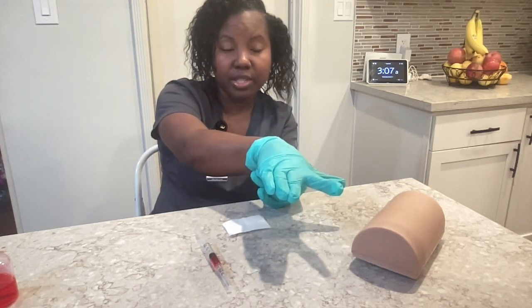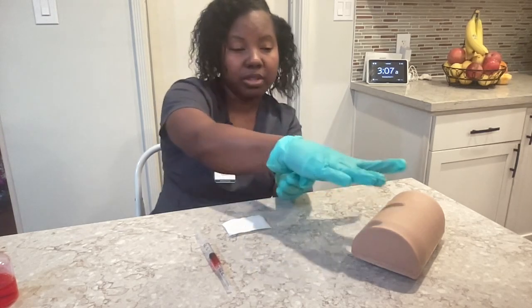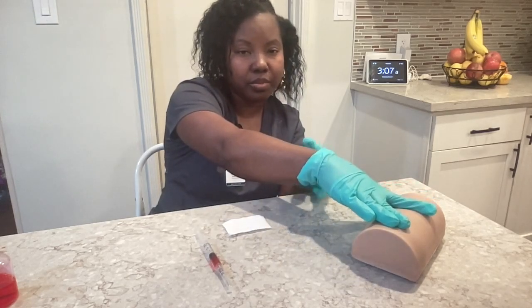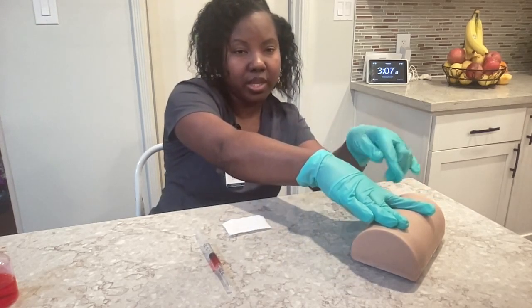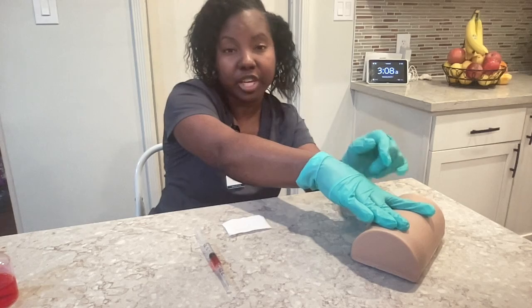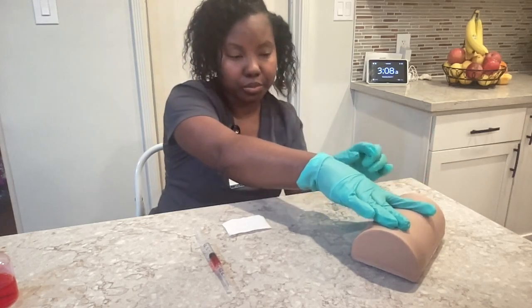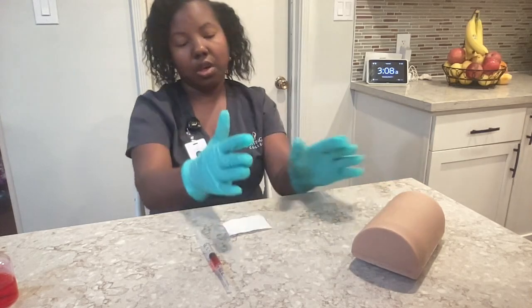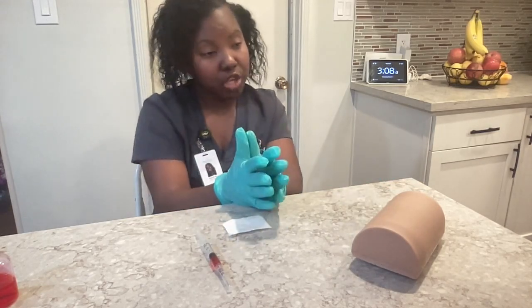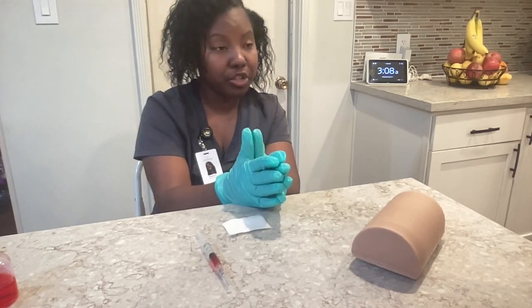You will make a V between your index finger and your middle finger, and the injection site is the spot in between. Mr. Jones, thank you so much for your patience. I have prepared your injection.